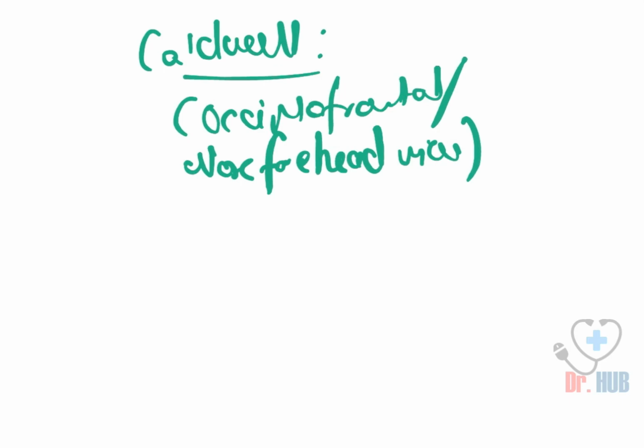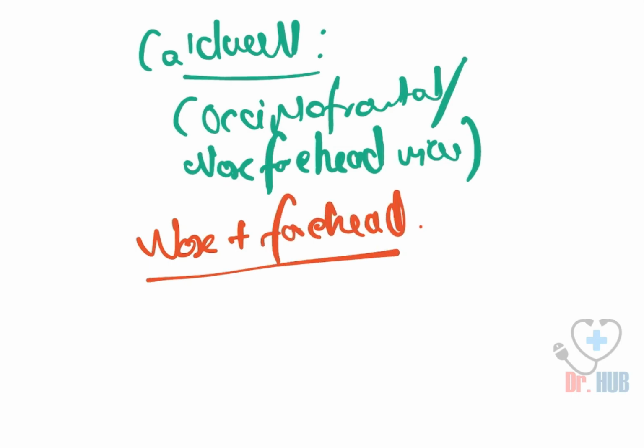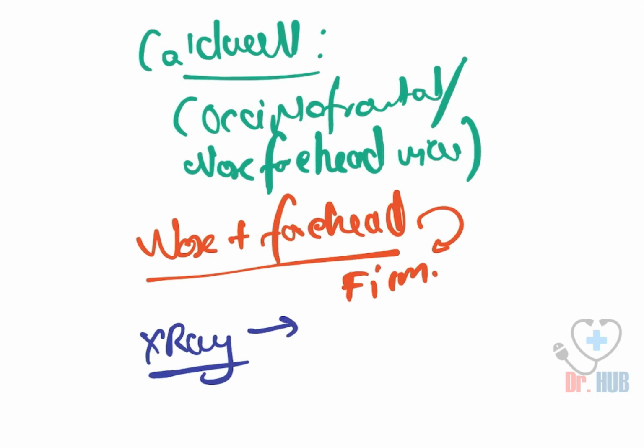So here the view is taken with the nose and the forehead touching the film. The X-ray beam is projected 15 to 20 degrees caudally.